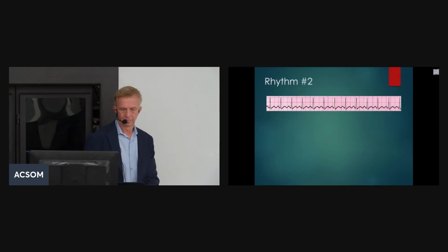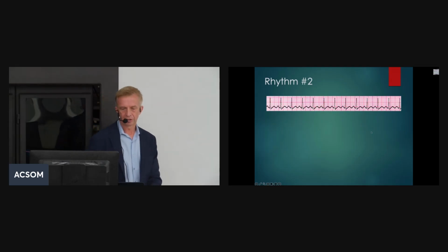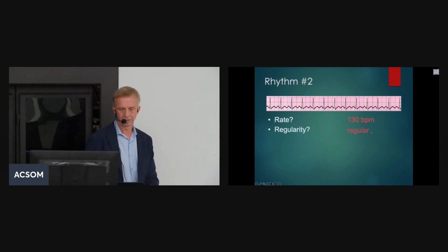All right. What is this? That's the opposite. Nice. So two big boxes, 300 divided by 2, around 150. It's a little bit less, so it's around 140, I think, the heart rate. You can see again the P waves, normal PR interval, P wave in front of each QRS complex. So it originates in the sinus node, and it's a regular rhythm: sinus tachycardia. Around 130, they meant.